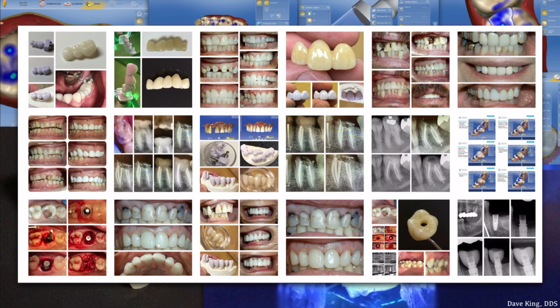It was interesting. You don't see the whole picture here, but I decoronated the tooth. You can still see the roots here. I decoronated the tooth, we drilled the osteotomy using the surgical guide, then I took the roots out. You can see little root crypts here, 1, 2, 3.